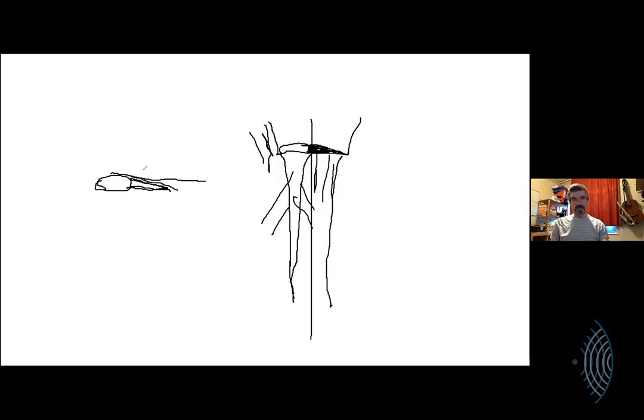You kind of just rolled your eyes when he inferred that it braided together. There may be some braiding of some fibers, but you see infraspinatus in short axis, in long axis of supraspinatus, and the short axis of infraspinatus looks very similar to subscapularis. Wow. I want to see that sometime, John. When you see that, save it and share it with me. Keep drawing, because I'm learning from you here, buddy. Yeah. I see it all the time, and it's on loads of these videos.